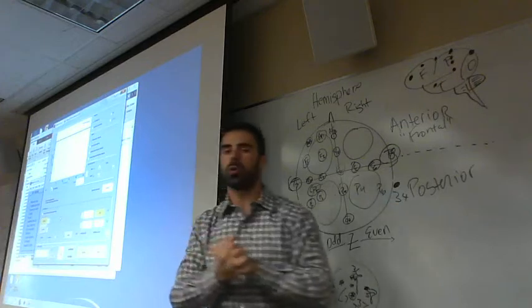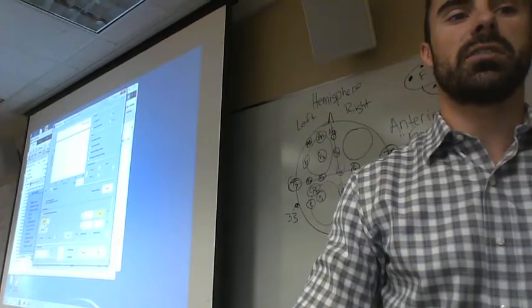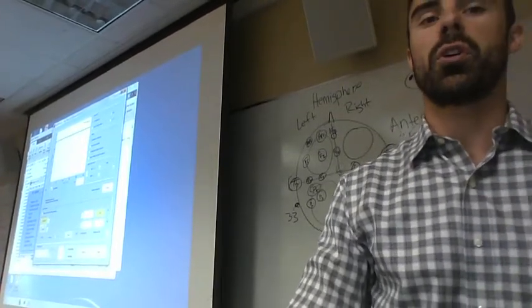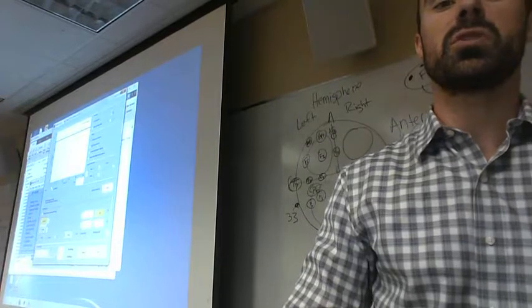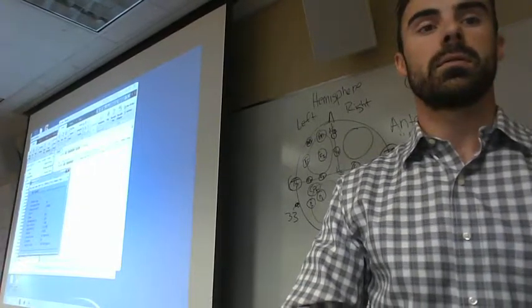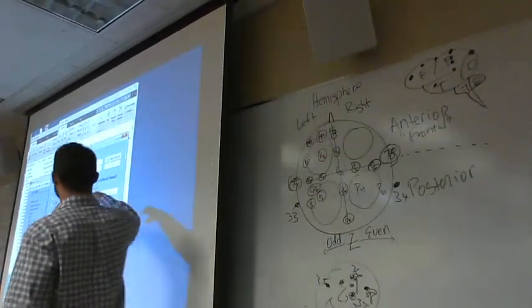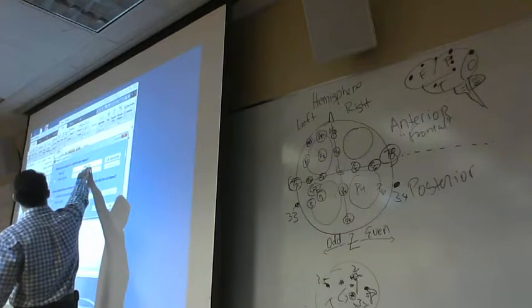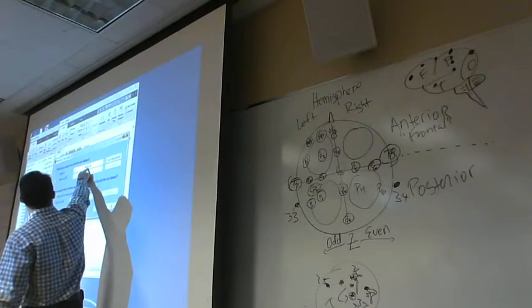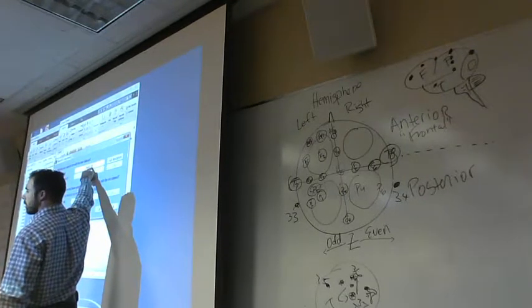Okay, so we're going to do a high pass filter. You keep that clicked on, like the little yellow square box on high pass. We're going to keep it at 0.1 hertz. That keeps it really slow, and we're just going to hit apply. So pretty much you just open the GUI and hit apply. It'll think for a minute. It'll crunch it out, and it'll ask us, what do you want to do with the new data set? It saves our name here, re-reference, and then gives underscore for filter. Okay, we're going to do that.